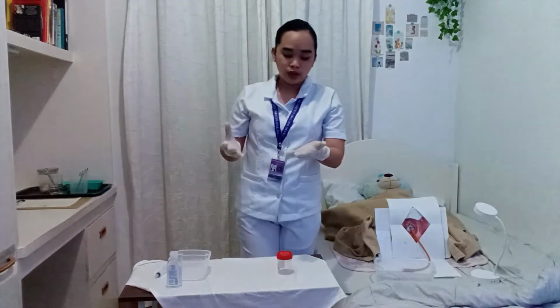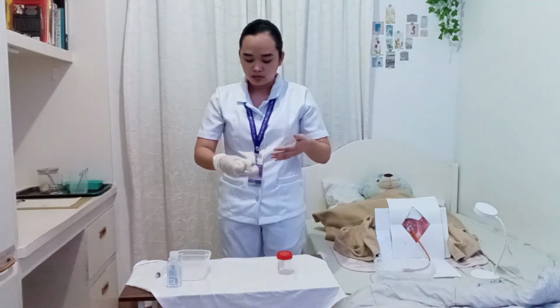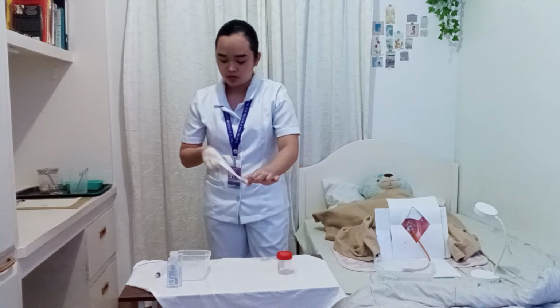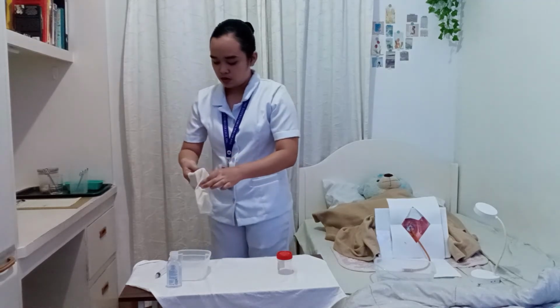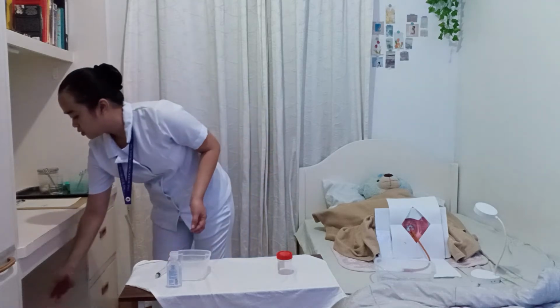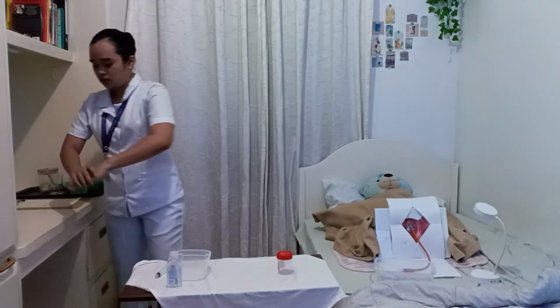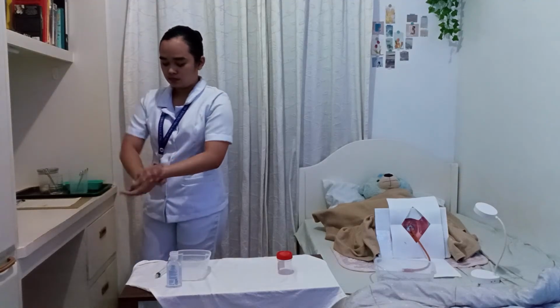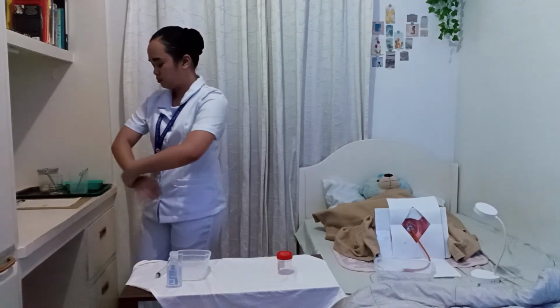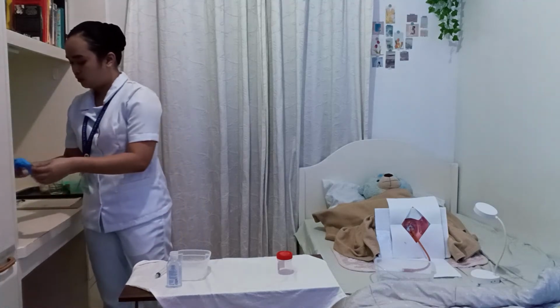And now I'm going to remove my gloves. Okay. I'm going to discard it. I'm going to perform hand hygiene. And I'm going to wear a clean pair of gloves.